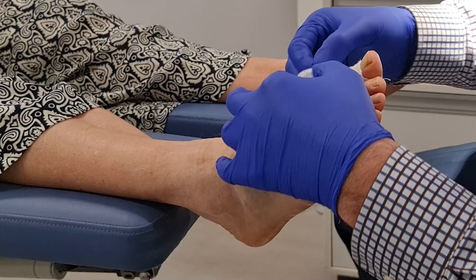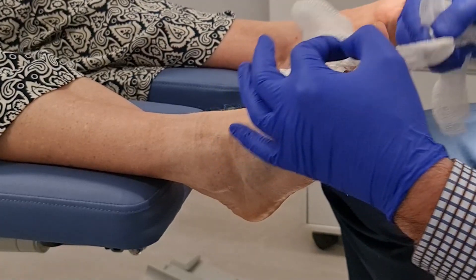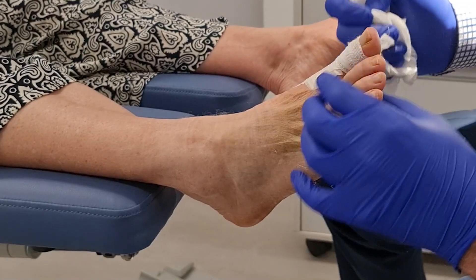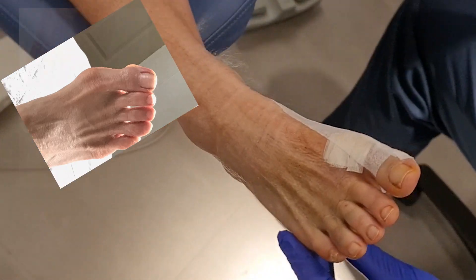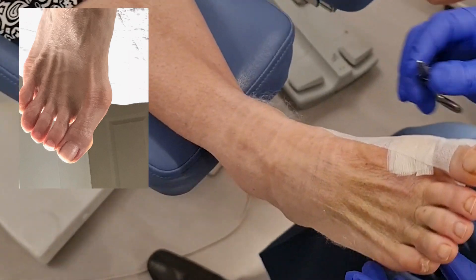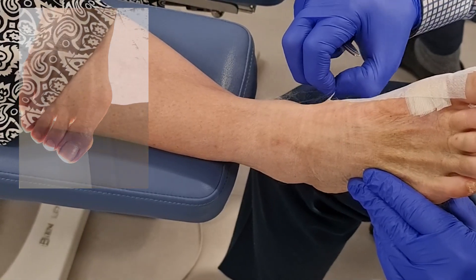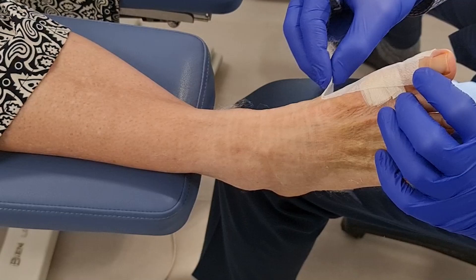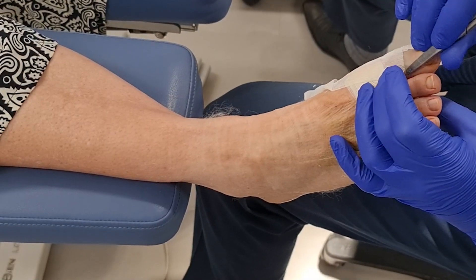This is how it looks at week 2 — just two days short of week 2. Let's take this strapping away, then we're going to remove the steristrips, cut the suture ends, and have a peek at how much swelling there is. It doesn't look like there's a lot.